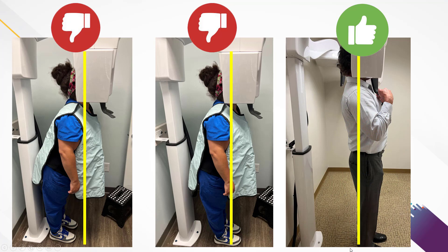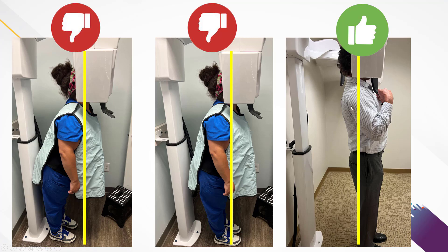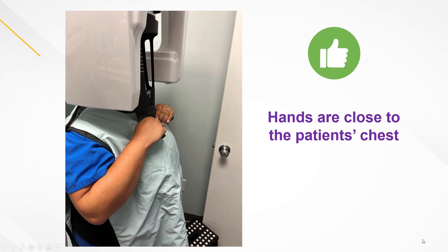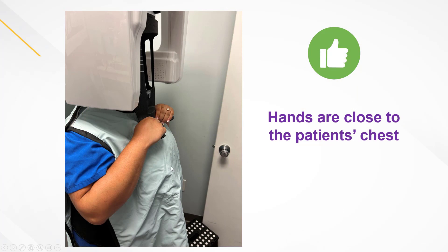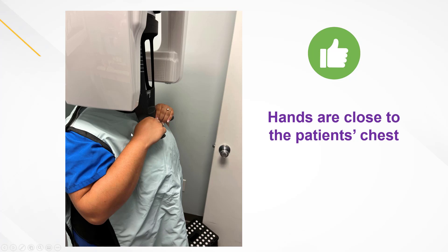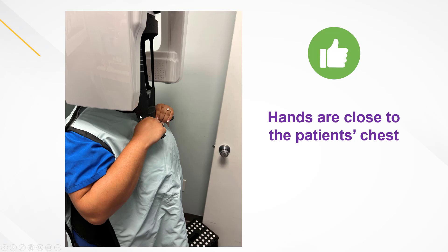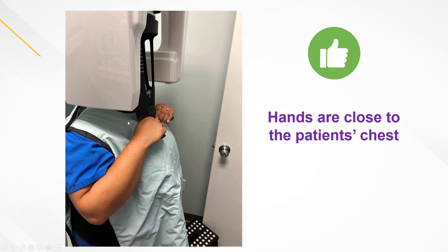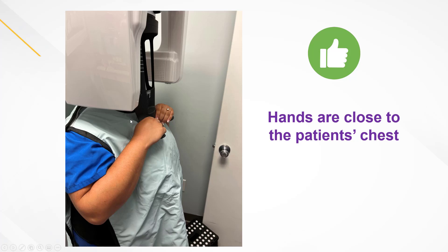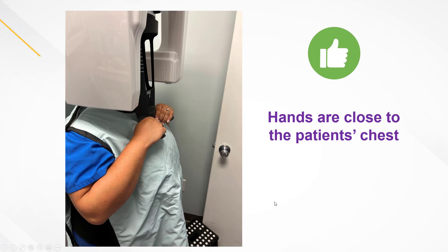You could even have the patient shuffle their feet forward a little bit further — in this example, they're actually angled back just a tad as well. One other thing to notice is the patient's hands are very close to her chest, which is what we really want. You don't want them leaning into the machine. If there's a large gap between the patient's hands and the black mask on the patient's chest, that's an indication they're leaning in way too much. Shuffling their feet forward and getting nice and close is a good indicator that we're in a much better position.